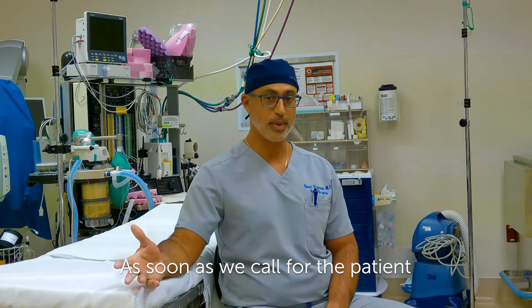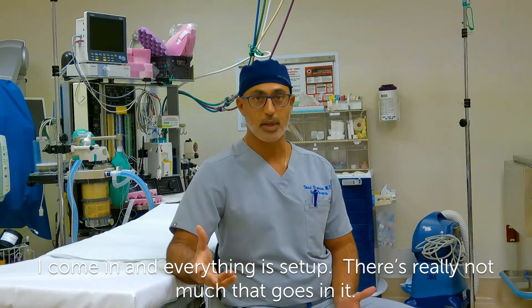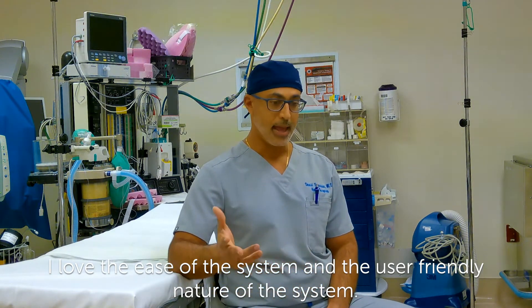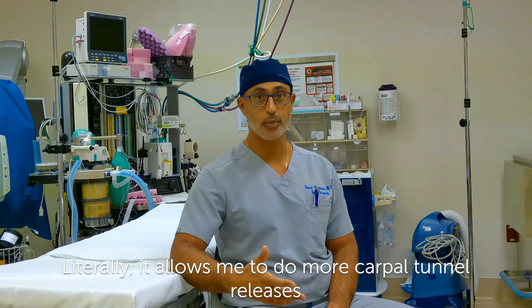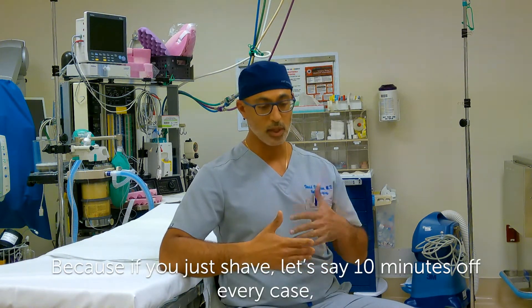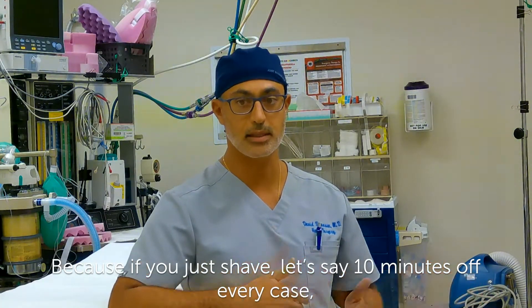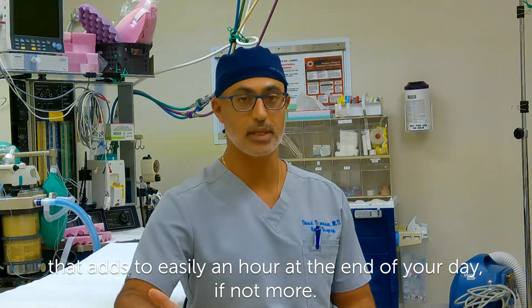It decreases the setup. As soon as we call for the patient, I come in, everything's set up, there's really not much that goes into it. I love the ease of the system and the user-friendly nature of the system. It literally allows me to do more carpal tunnel releases or more procedures just by using the system. Because if you shave, let's say, 10 minutes off every case, that adds up to easily an hour at the end of your day, if not more.